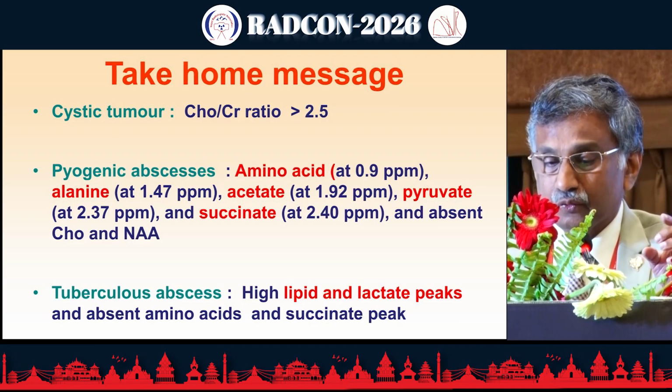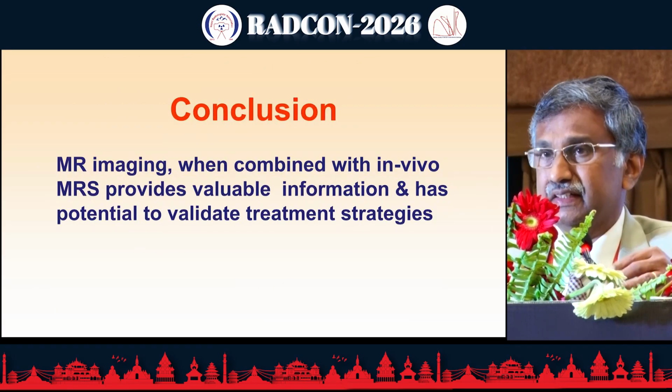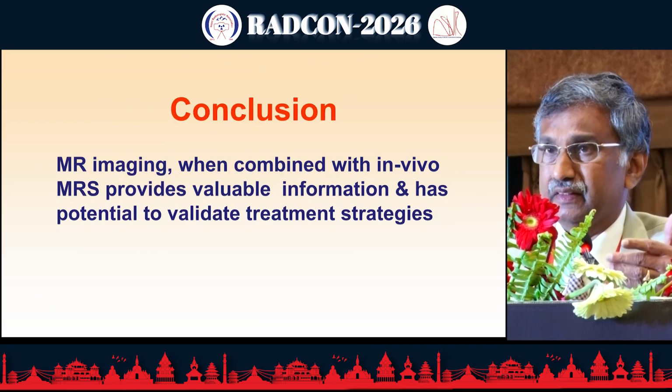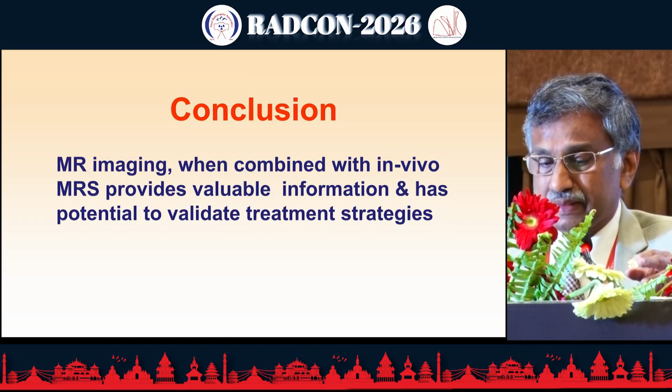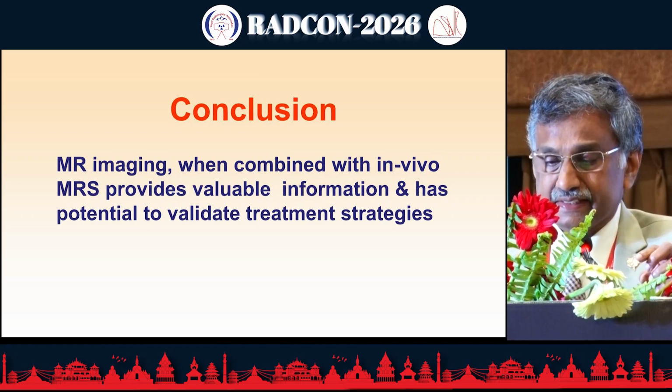Okay, to conclude, MR spectroscopy, when combined with routine conventional imaging, particularly diffusion and other sequences, provides valuable information as a potential guide to treatment strategy.